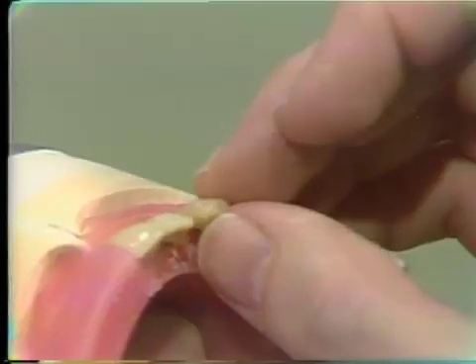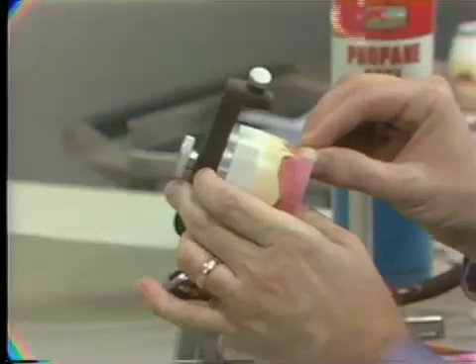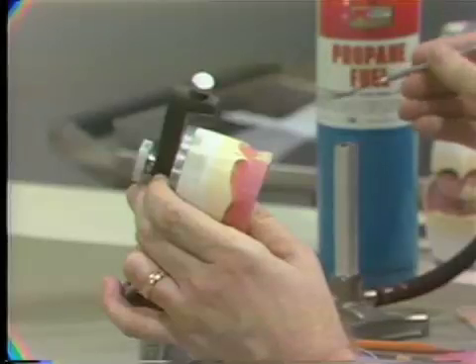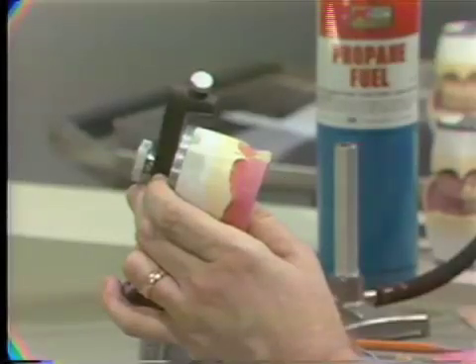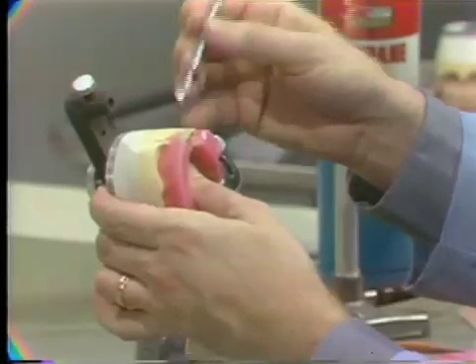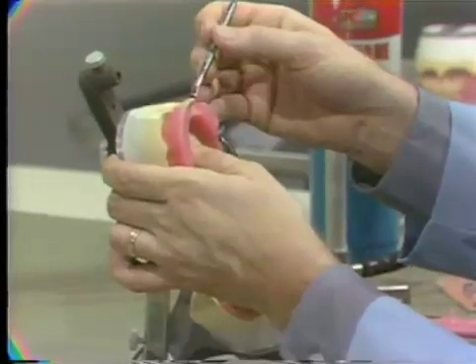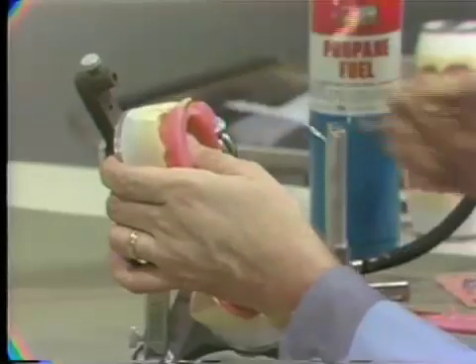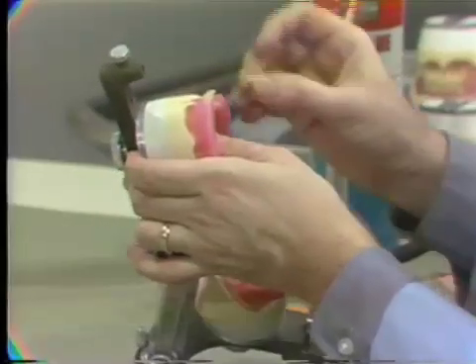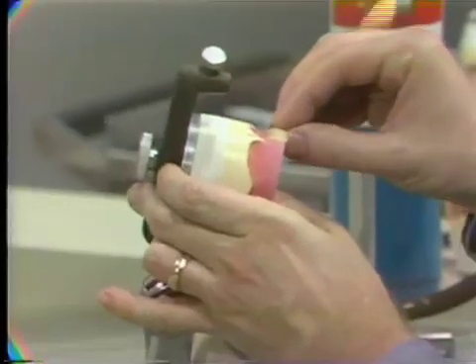Now you'll notice, and you can see it on the teeth that you have in your kit, and look at it when you get the tooth out, that there are two directions in the incisal portion of the cuspid tooth. The mesial edge, the incisal edge of the cuspid, should be in line with the other two anterior teeth. The posterior incisal edge of the cuspid tooth, we line that up so it twists slightly to the distal and actually forms the first part of the line down the ridge, which forms the line for setting the posterior denture teeth. And when you get your teeth out, take a look at the incisal edge of the cuspid and you'll see these characteristics that I've just described. It shows it very nicely on this particular tooth.